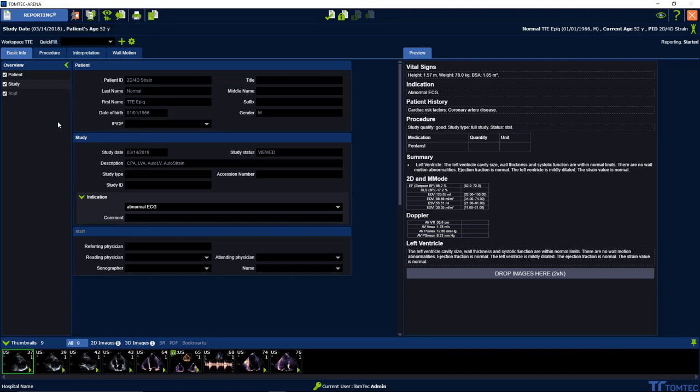Filling the report is quite simple. On the top here you can see four different folders: basic info, procedure, interpretation, and wall motion.